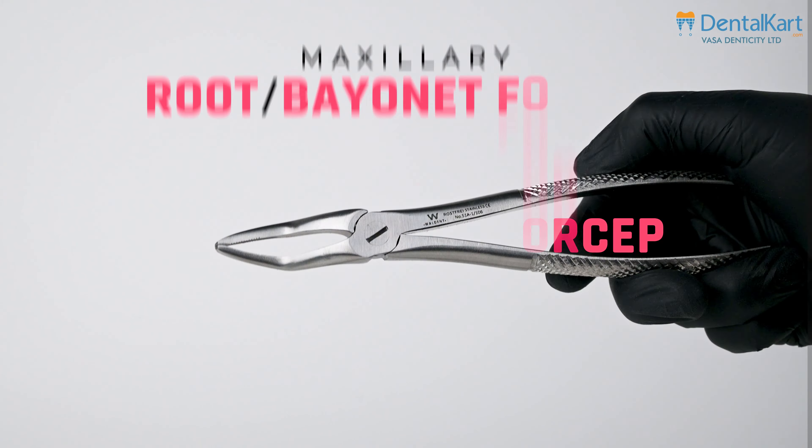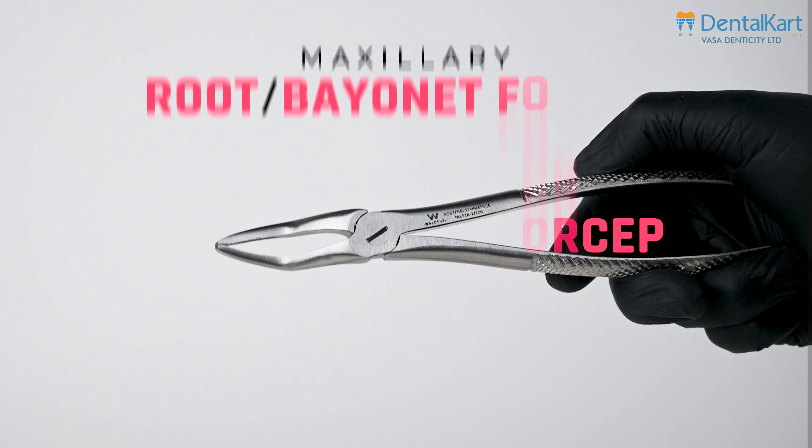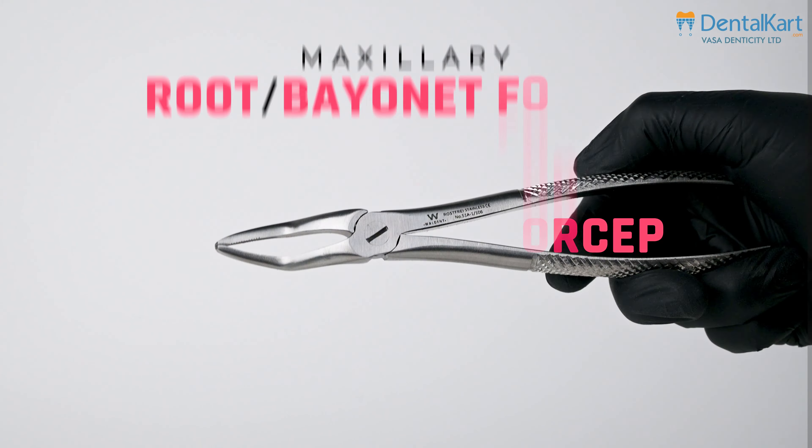The maxillary third molar forcep stands as the longest among its maxillary counterparts, owing to its reach to the posterior third molar. Crafted with smooth concave beaks, it gracefully adapts to the diverse anatomical intricacies of the third molar.